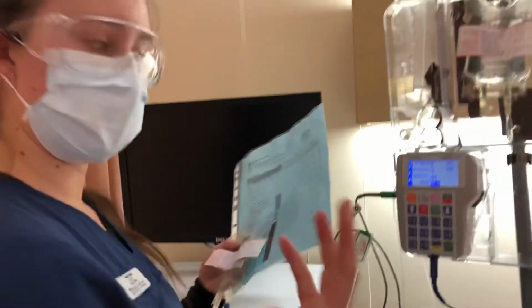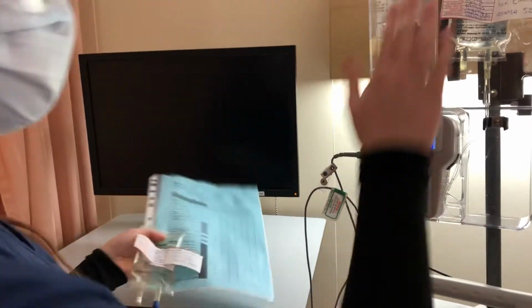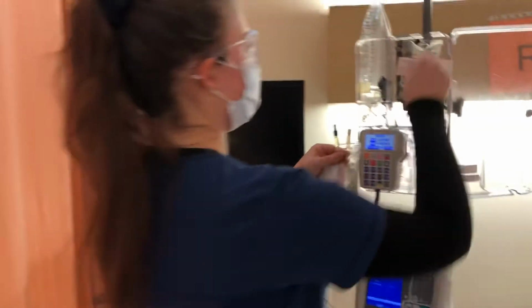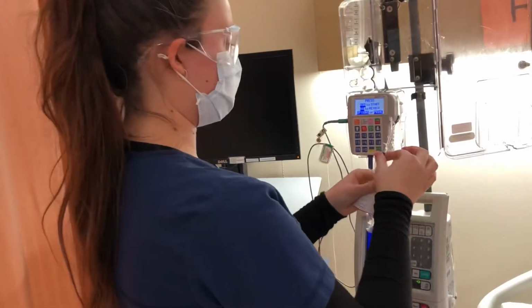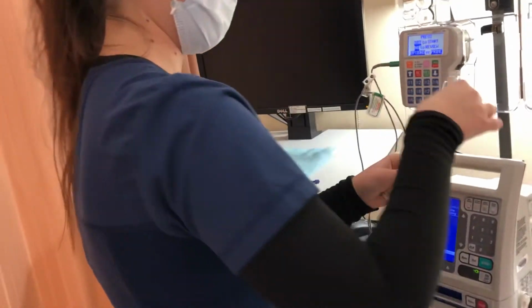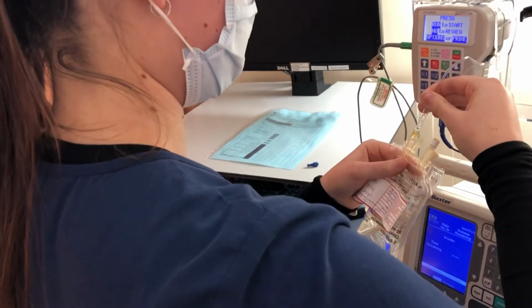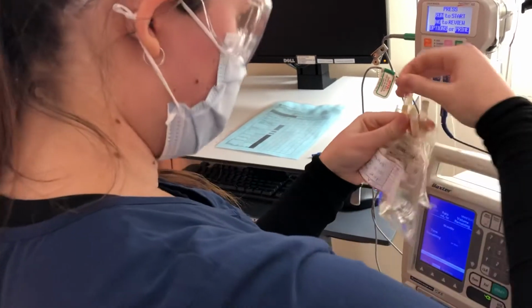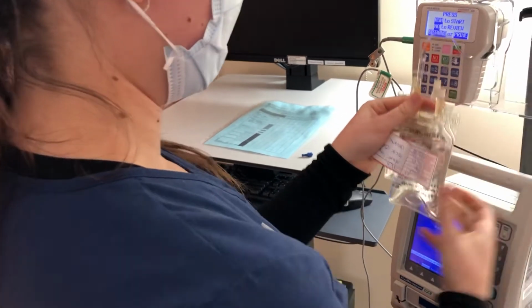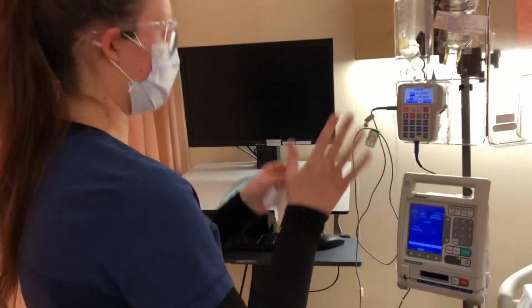Yes, I've had the second nurse verify that everything I put into the pump was correct, as well as referencing my MAR and my mini bag. So now I'm going to be switching out this bag for the one that's currently in here. I'm going to maintain sterility of the spike here. I spilled a little bit of the old bag on the floor, so I'll be cleaning that up before I leave. That is spiked, so I'll hang this here. And I'll be med wasting of this with the second nurse after I leave the room.